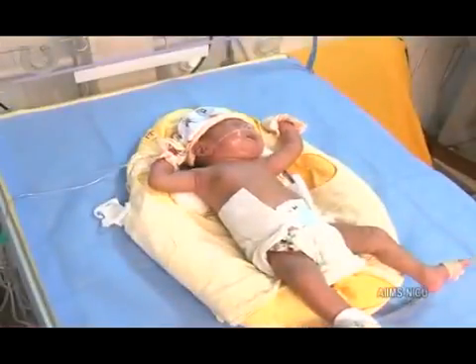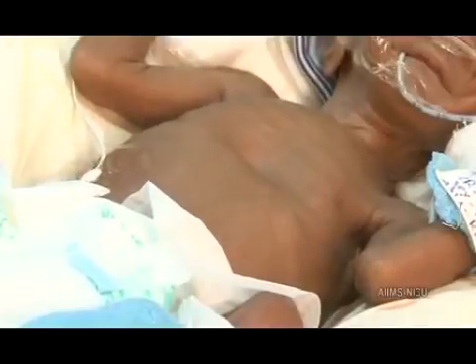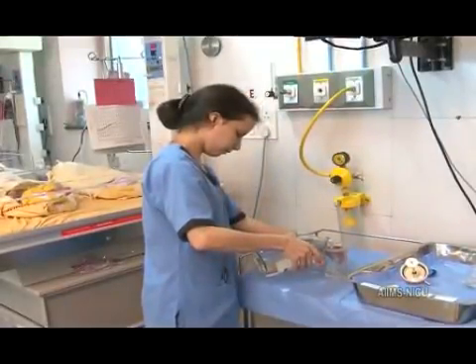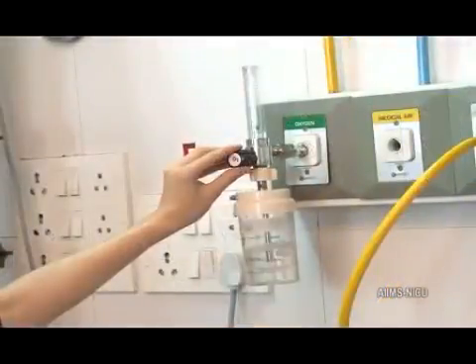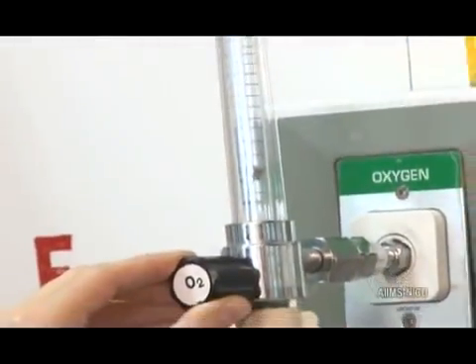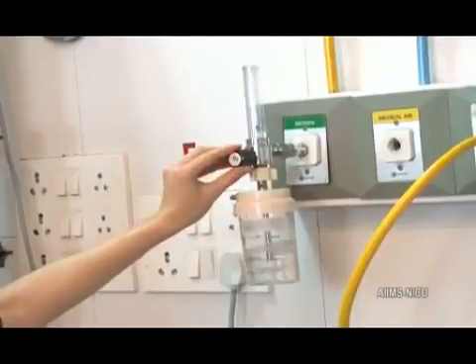Let us now understand the important points which are to be considered while administering oxygen by nasal cannulae. Fill the humidifier with distilled water so that the oxygen delivered is humidified and not dry. Set the flow rate to 0.5 to 1 liter per minute. Observe if the bubbles are coming out in the humidification chamber. Remember, the flow rate should be adjusted as hyperoxemia can be damaging to the infant.